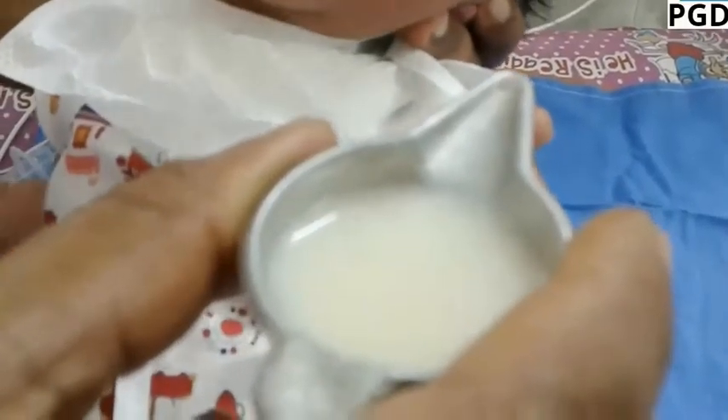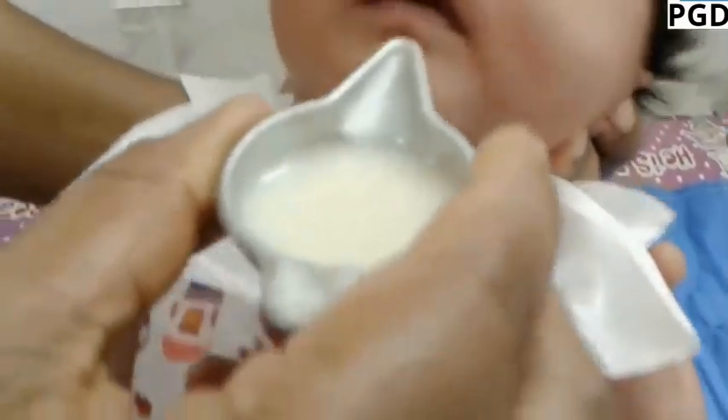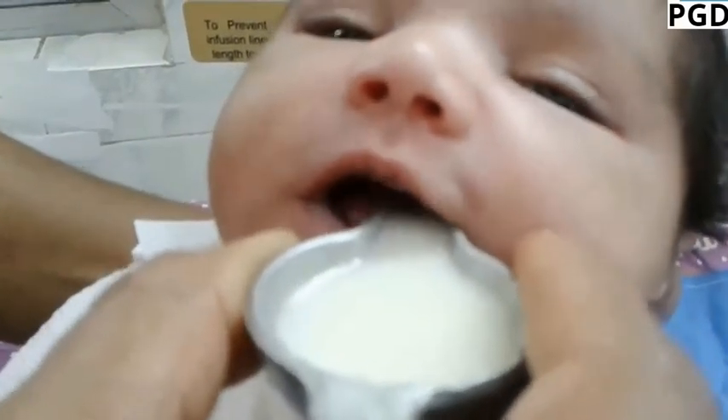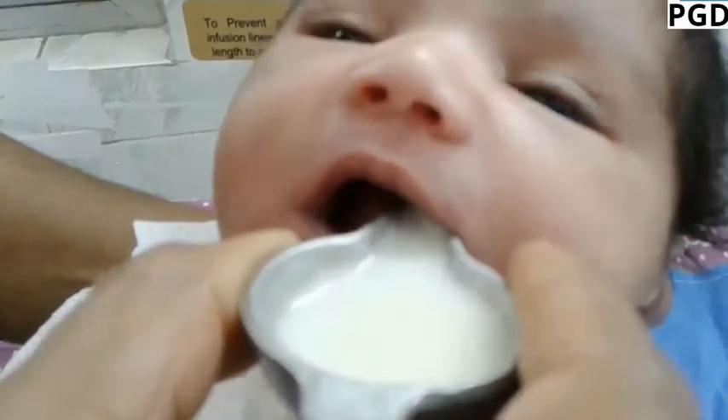Hold the paladay so that the pointed tip rests lightly on the infant's lower lip. Tilt the paladay to pour a small amount of milk into the infant's mouth slowly.